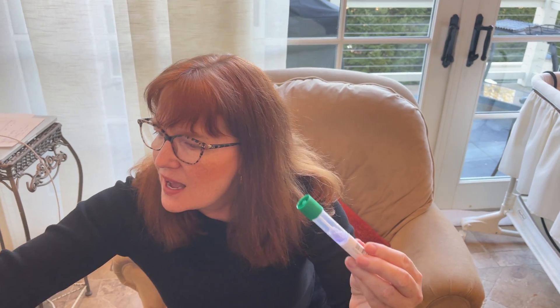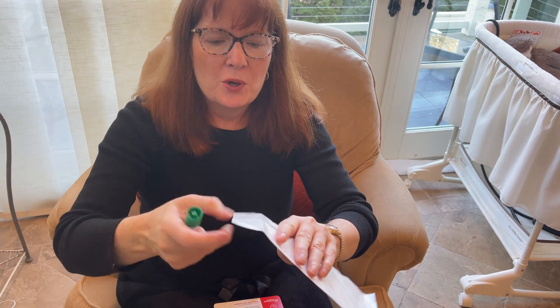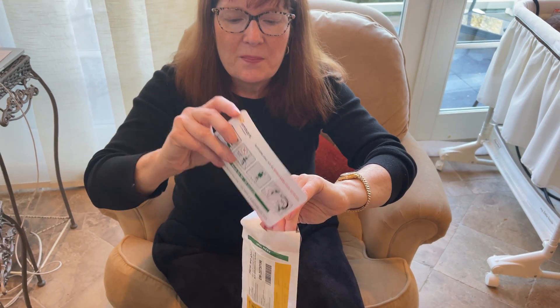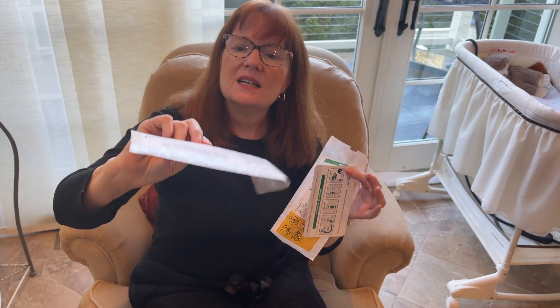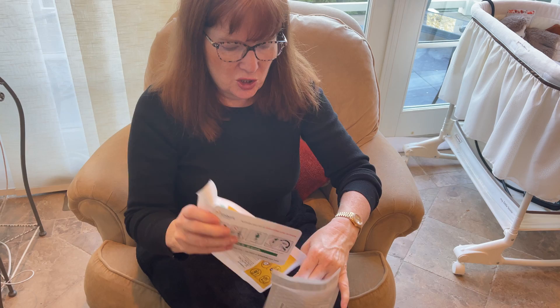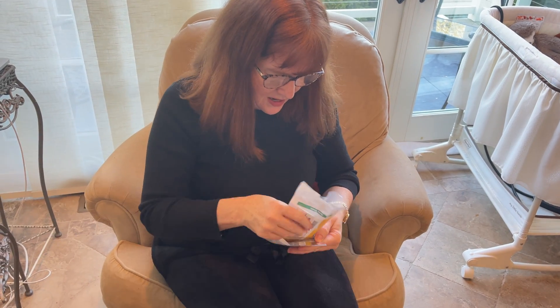Then I package all the materials back up. We've got the information — they want that packaged, so I put this inside like so. I send them back their instructions so that they could potentially reuse them. Here's the little envelope they send along. I package everything into the envelope, seal it up, and mail it. That's what we do to complete the Embark DNA test.